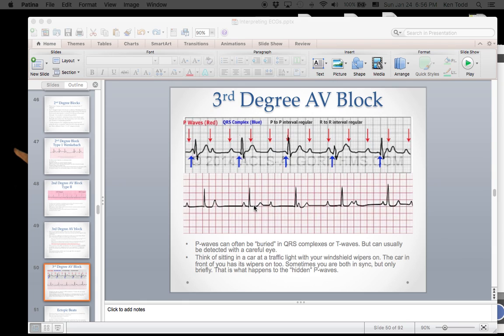I'll post some websites that have some good tutorials at recognizing blocks. This is usually one of the trickier things for people. If you're doing good with this, you're doing great.